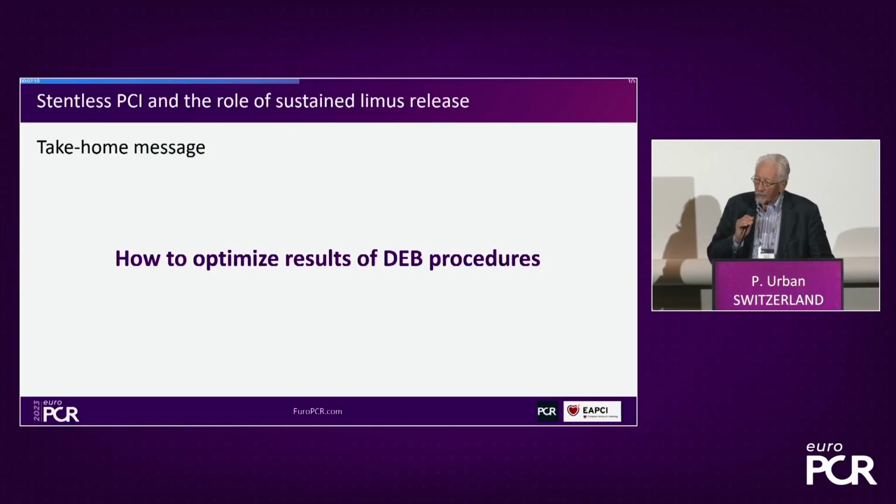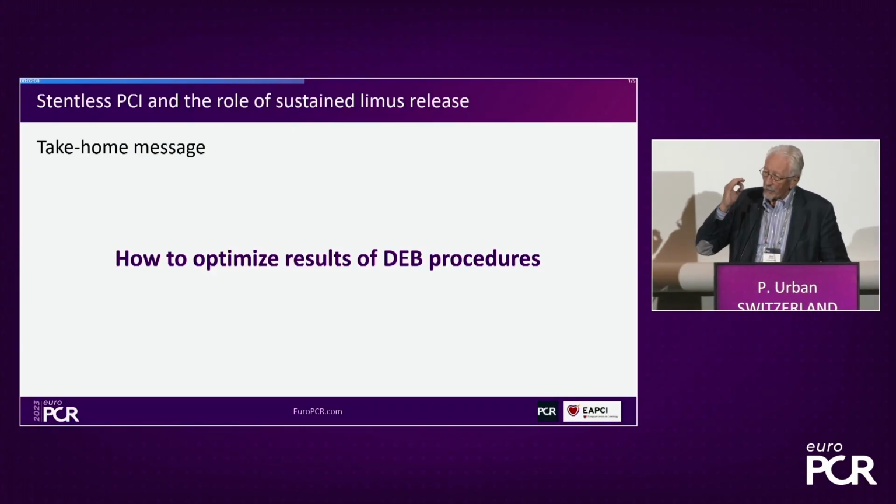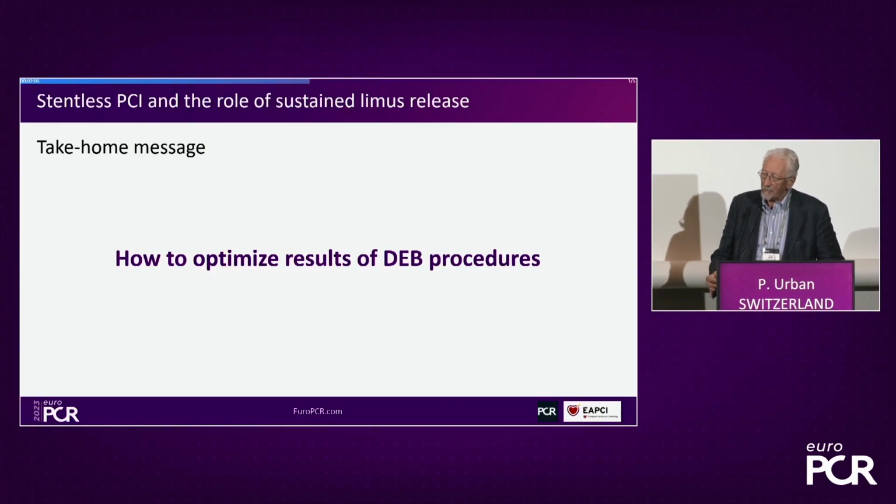We also have to accept the fact that it's been drilled into our minds that leaving a dissection after a procedure, which is always a stent, is bad, bad, bad. Edge dissection. This is not edge dissection. This is balloon-induced dissection. And therefore, we have to change the way we're looking at the angiograms and try and make ourselves understand that this is actually not a great deal. And Simon knew all along, and we're finding out.